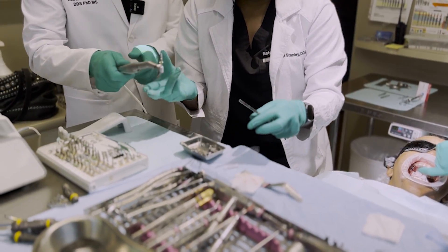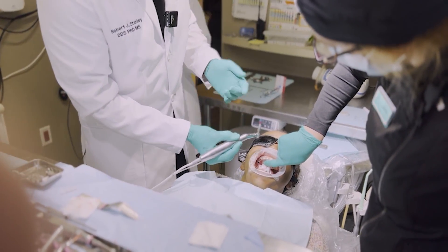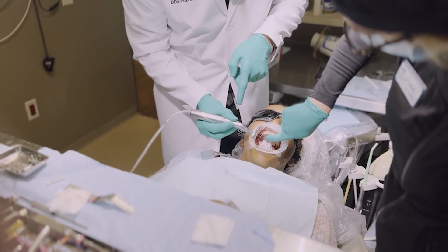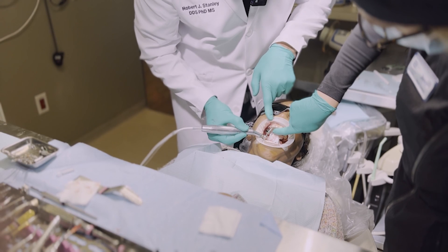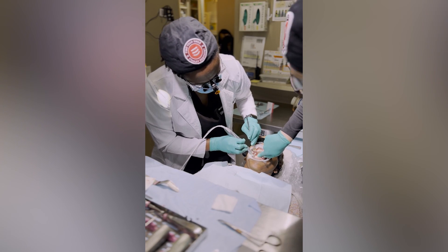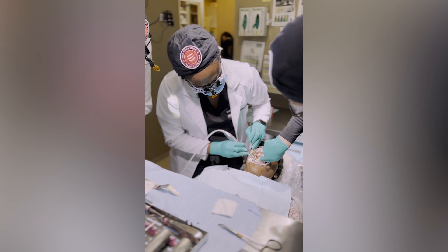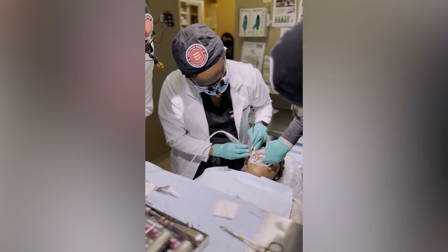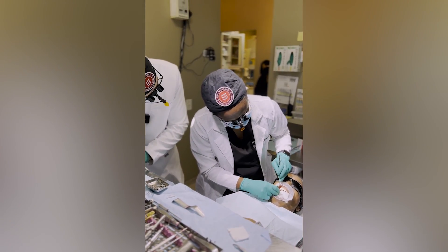Let me show you how I go to the mouth with this. I'm holding it up like this — I even put my hand underneath it because I don't want to lose it. Take the back of this to the back of the mouth first, then come forward. Don't try to put this in from the front — it'll fall to the back of the mouth. So you go back first and then enter the hole. Speed has changed. It's not going in — wiggle a little bit so it starts to engage. There it goes. As soon as it touches, you're done. And then just get it nice and finger tight, give it a good twist. That's all I do.